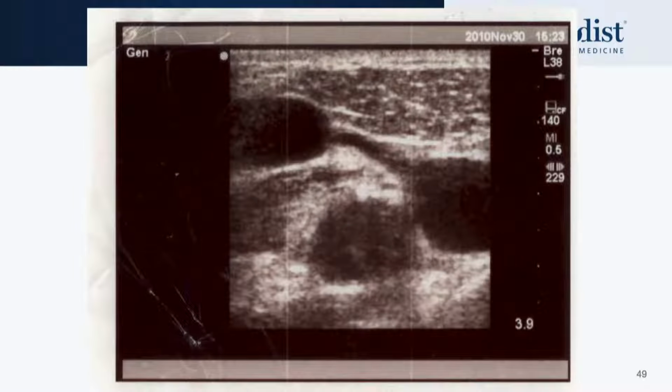Clinically, you can feel that by having a thrill over the sort of medial clavicle, or you can see it with ultrasound, etc. And there it is. It's kind of that tough fascia that it's having to penetrate through, and it is not dilated.